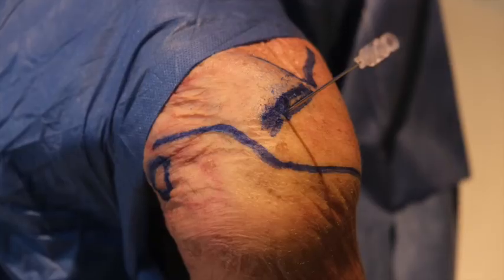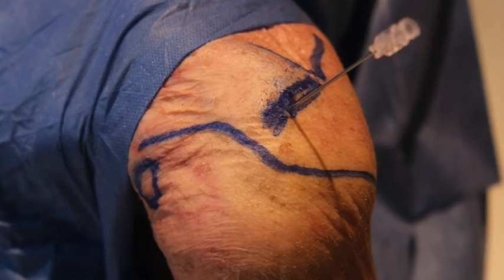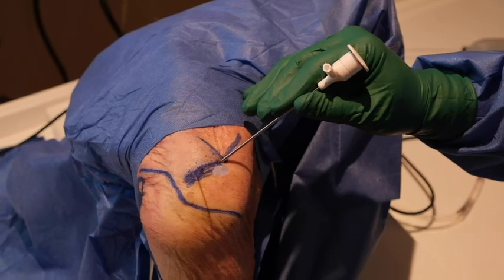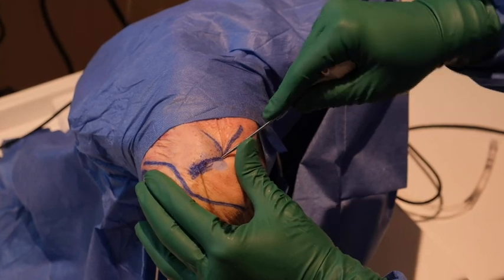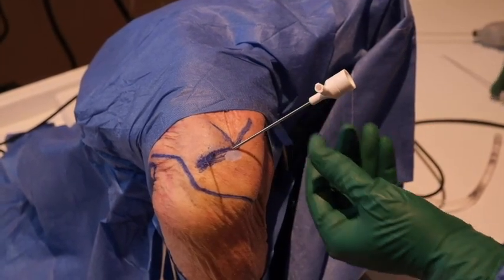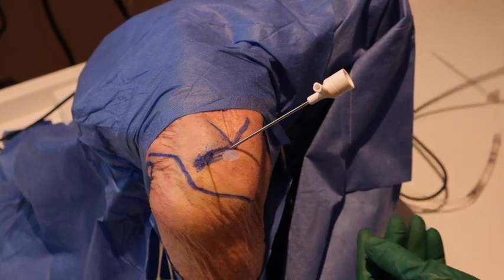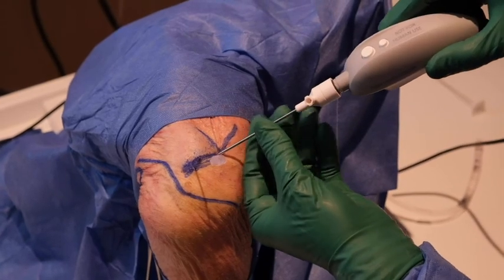We start the procedure by locating the acromioclavicular joint with a spinal needle. The posterior portal is located just posterior to the joint and can be created percutaneously with no formal incision. The skin is penetrated using the sheath of the nanoscope and a sharp trocar aiming 30 degrees caudally. This percutaneous method without using a scalpel allows less fluid extravasation and better pressure control.